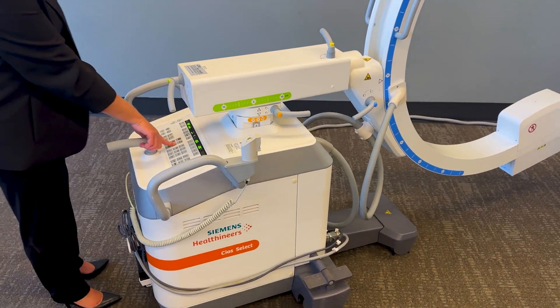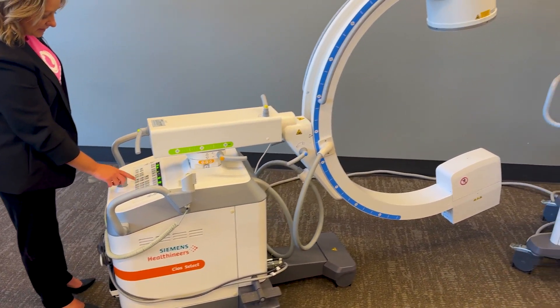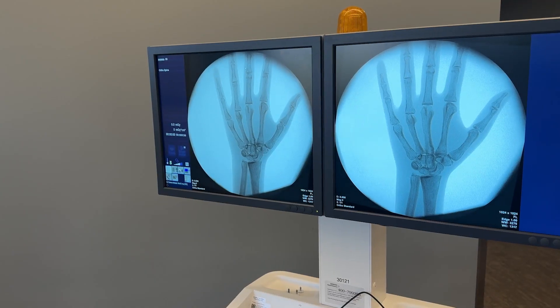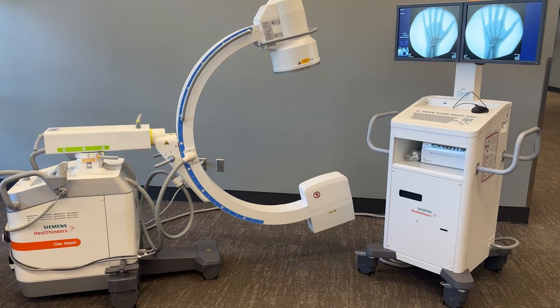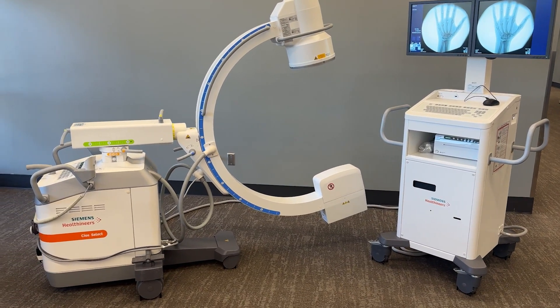You are able to manipulate your image at the touch of a button, changing your brightness and contrast. Very simple, nice machine.